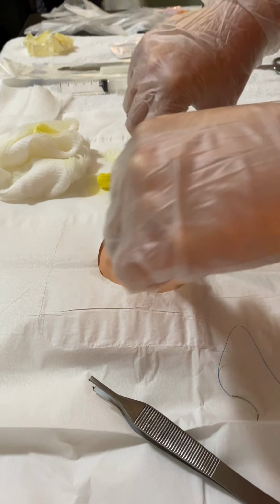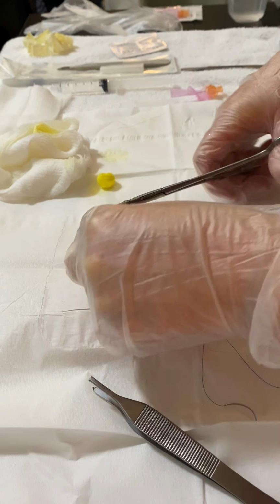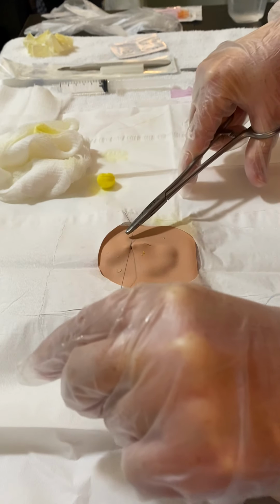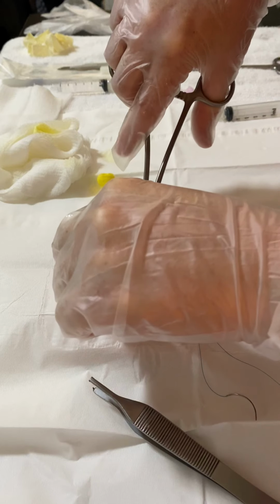And then making a loop. And then back again.